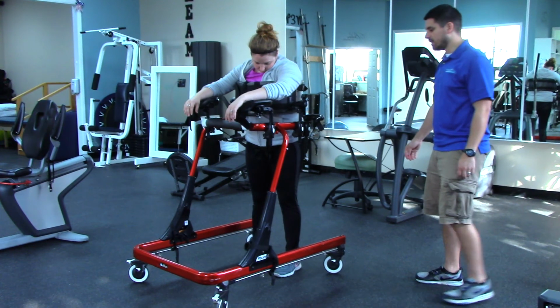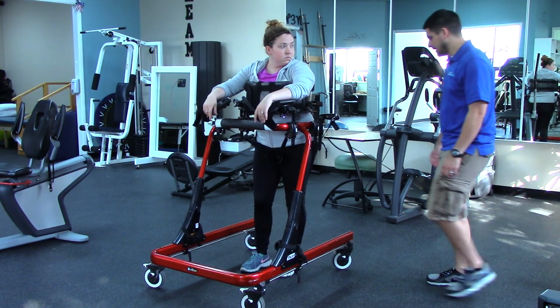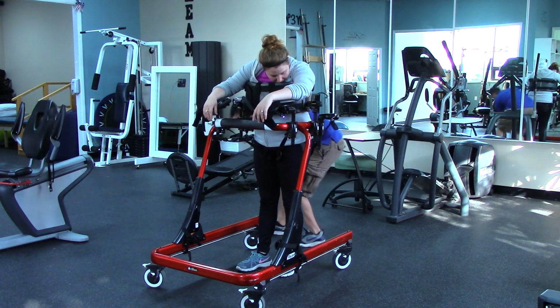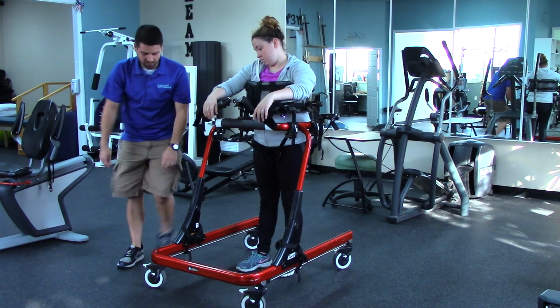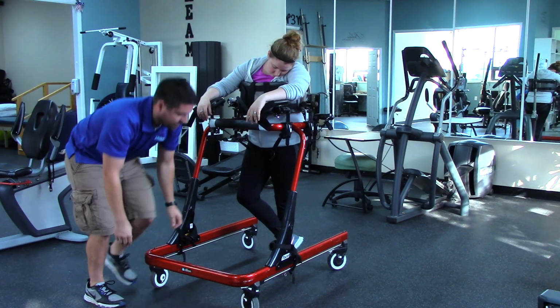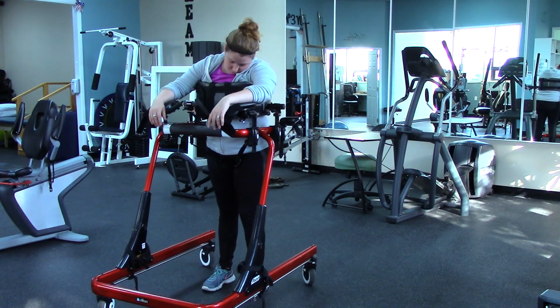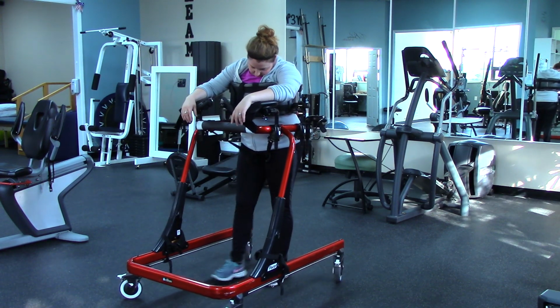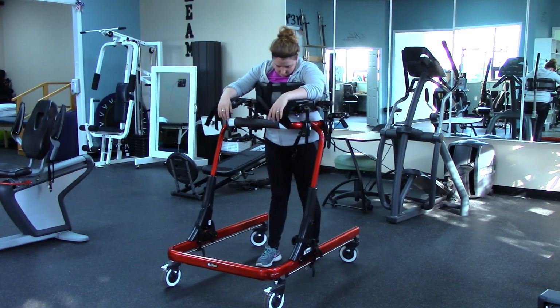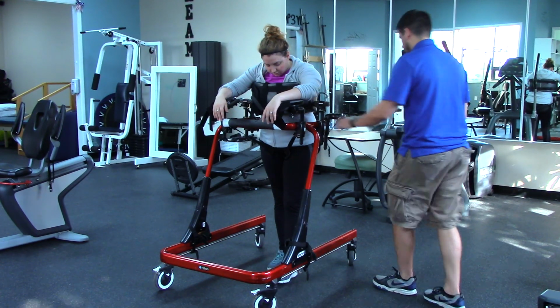Now, if we're really working on endurance for somebody and they're getting like 400 feet walking without a break, then my next step is going to be starting to increase the drag, which is this inner part of the wheel right here. I'm going to increase that. So now, go ahead and try to move. See, it's a lot harder. That's about half drag. We still have more that we could increase to make it a little more difficult.